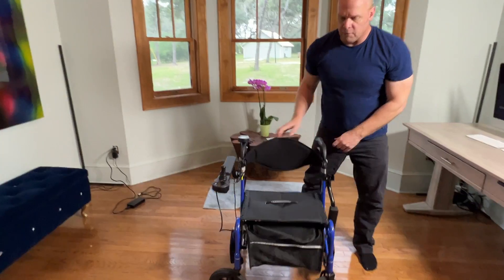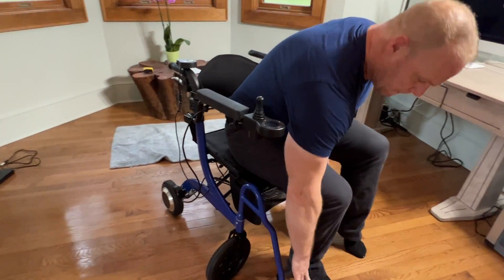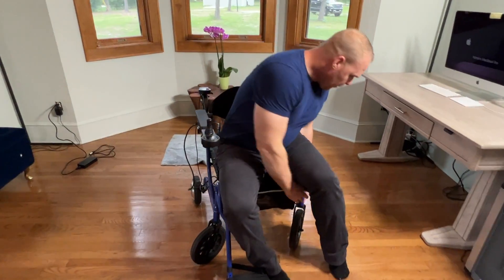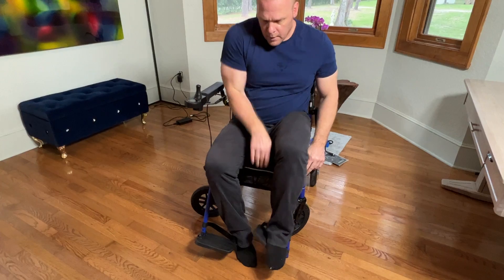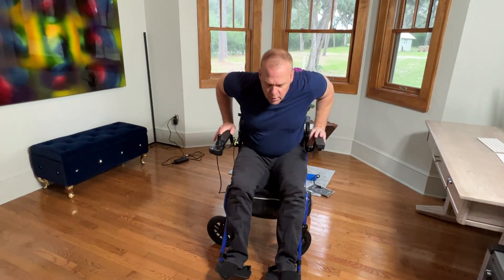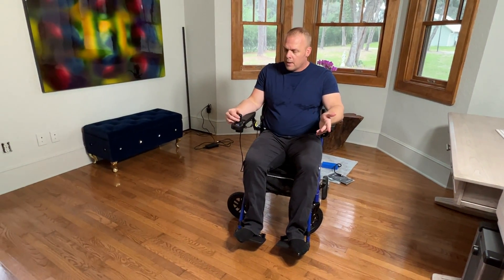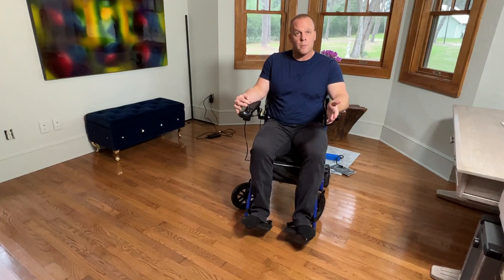You can turn that off and use this as a wheelchair — so easy to do, so simple. Just go ahead and push those buttons, they fall right into place, the arm comes back over, and I can turn this joystick on. And literally within a couple of moments I am in powered wheelchair mode.